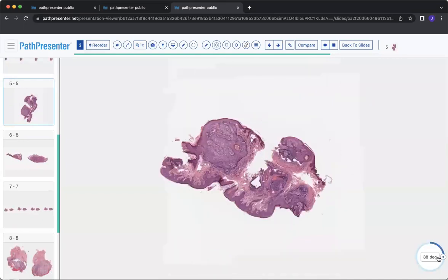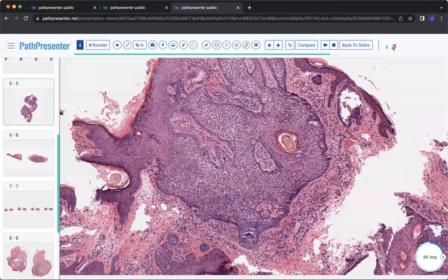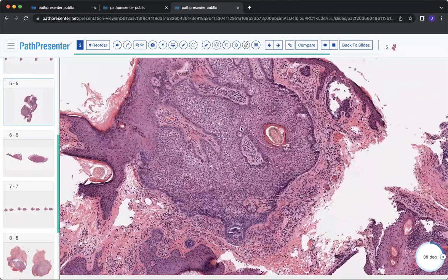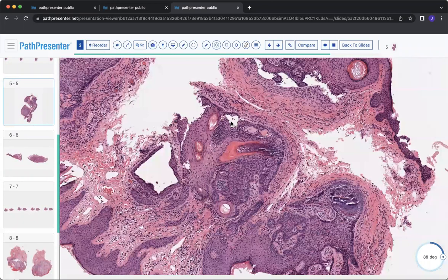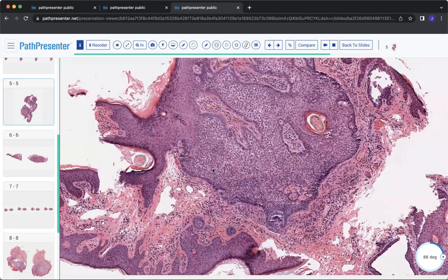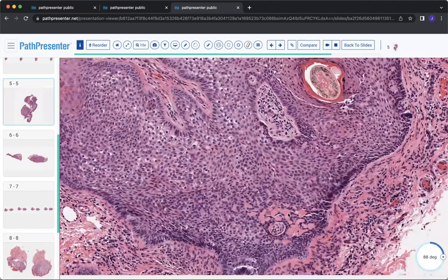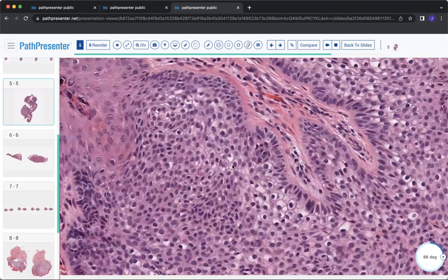Now, you may also get a digital slide of this entity and be asked to think of which genodermatosis it's associated with. From this power, it may be impossible to 100% determine what you're looking at. You'll probably notice the basaloid islands here, and you may be considering some type of basal cell carcinoma or some type of trichoepithelioma. As you go on higher power, though, you'll start to see this area of clear cell population.